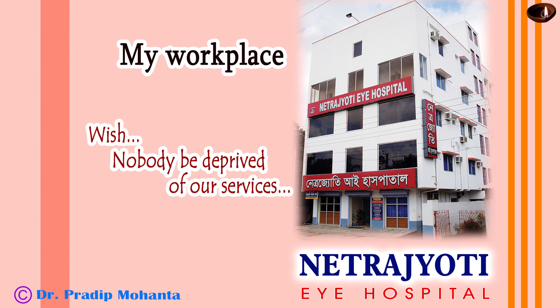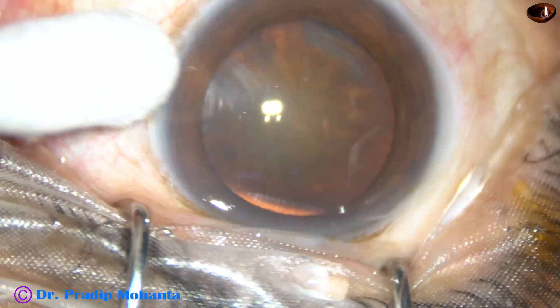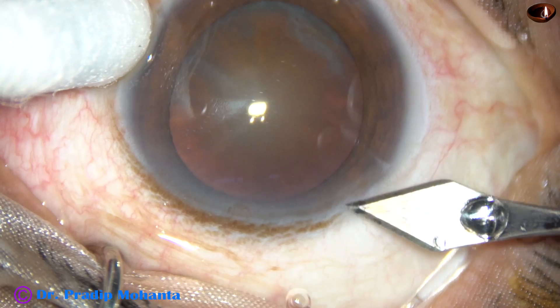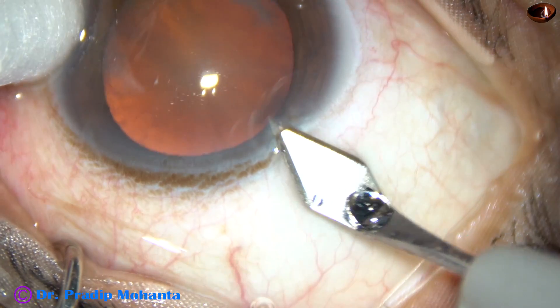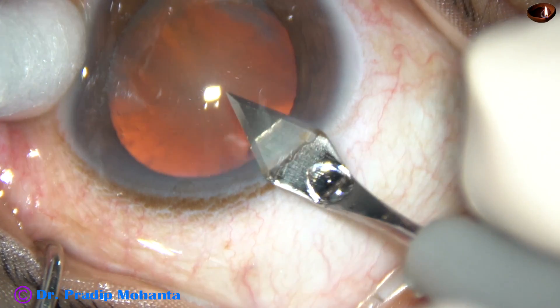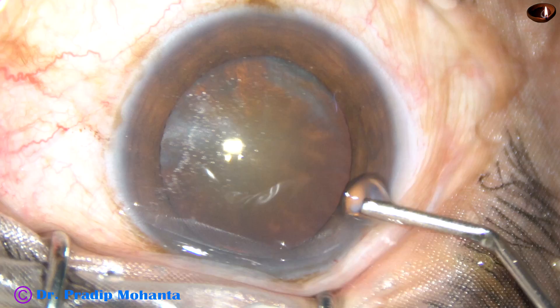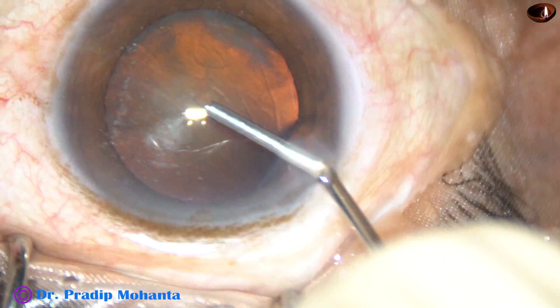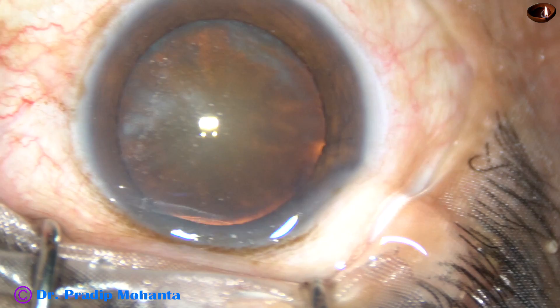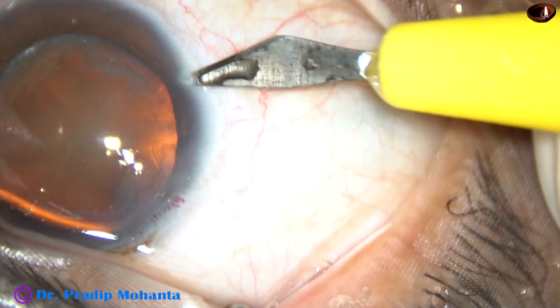Friends, welcome to my workplace at Ranaghat, West Bengal, India. In this video, I want to infuse into your cerebral cortex that if you see some nuclear fragments sitting over the posterior capsule, don't try to catch hold of those with the FACO needle. Lift them up with any blunt instrument like a blunt chopper and then use ultrasonic energy and consume them.